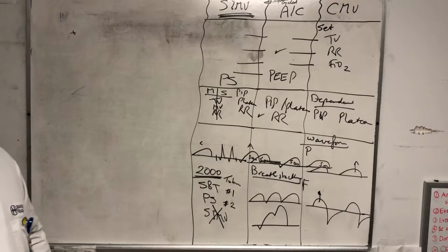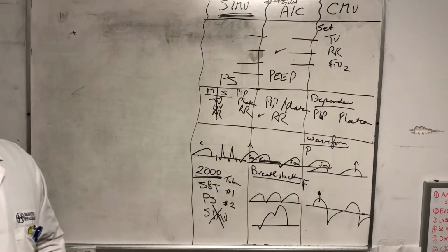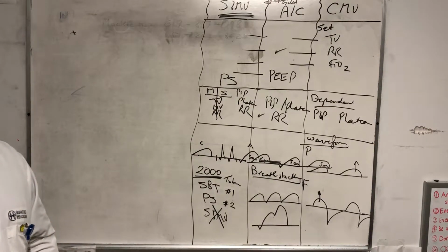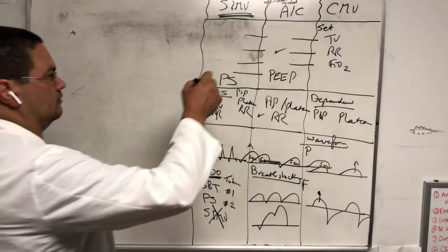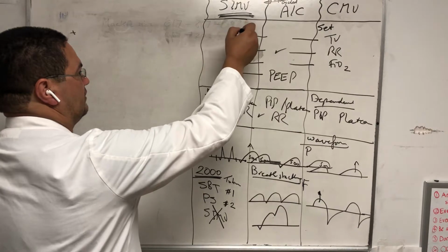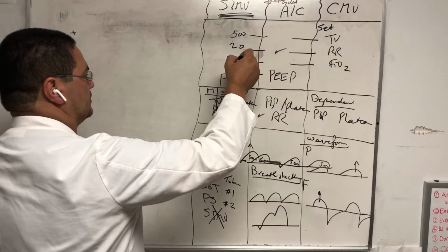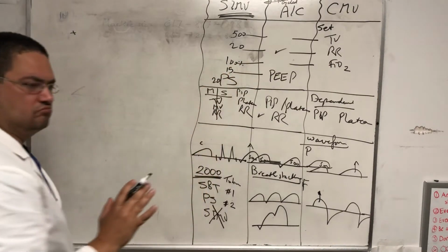So protocol-driven weaning was the way to go, and the protocol was that every 6 hours you change the vent by one thing. So you have four changes a day, and the changes have to be small and gradual. For example, you get somebody who has a 500 tidal volume, respiratory rate of 20, FiO2 of 100%, PEEP of 15, and pressure support of 20. Those are nice, good settings. The patient is sick.